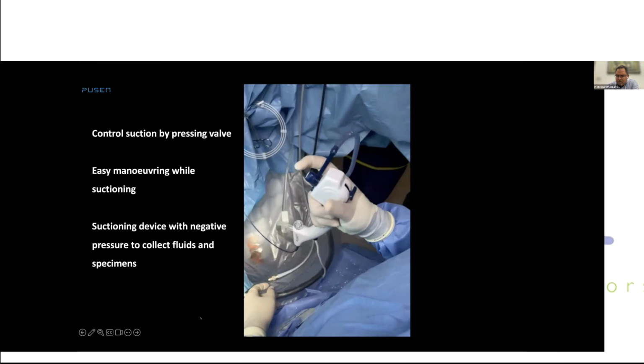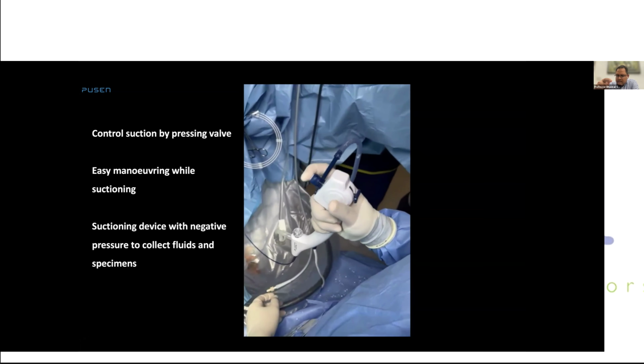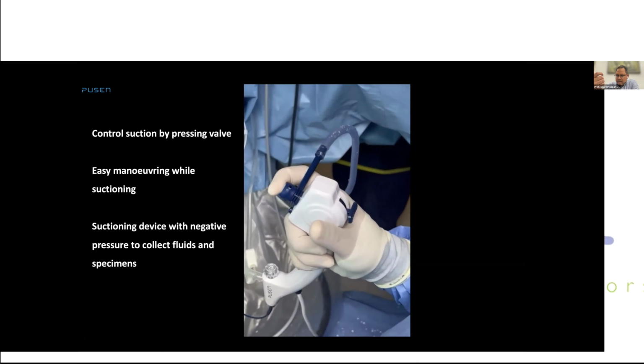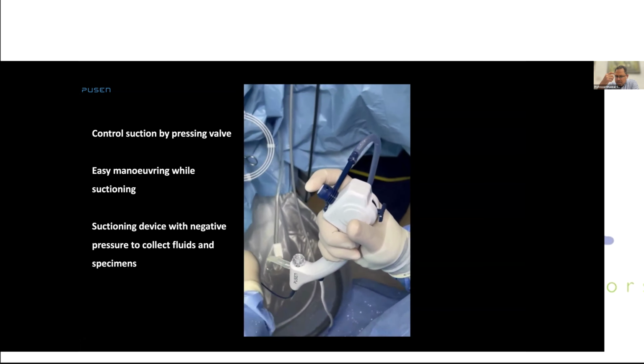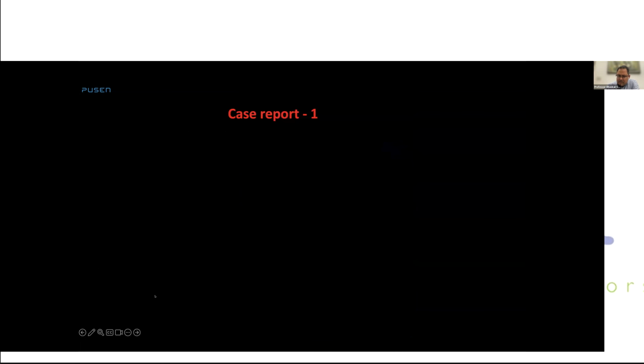How does it work? So the same channel, where the fluid is connected on the other side and the suction is connected, and you can see it's intuitive. And actually, sometimes when you're sucking, you have to be careful because you do need more irrigation, because otherwise the irrigation runs out. Now, just to also be very clear, it is not to suck fragments. If you want to suck fragments, you'll be disappointed. But it does suck the fine debris, etc.